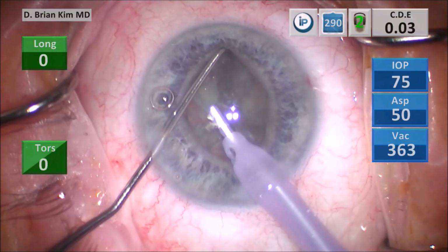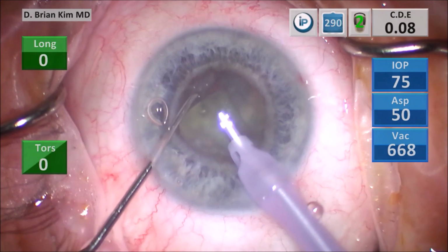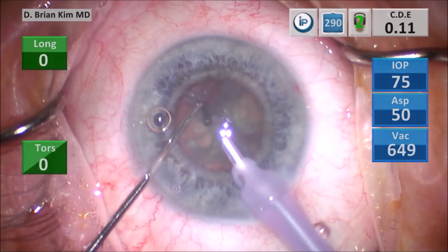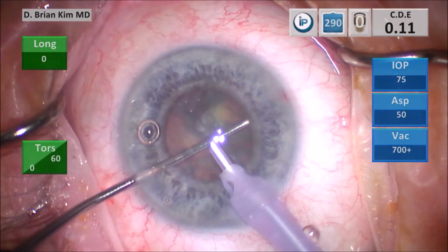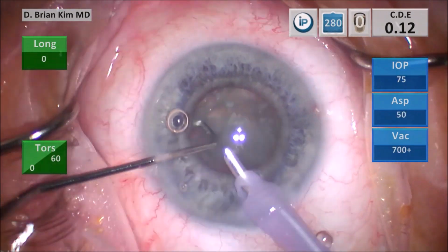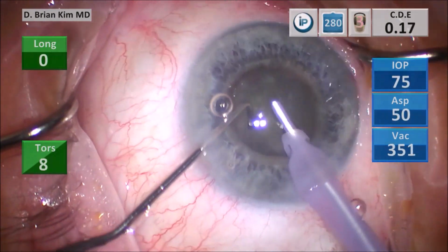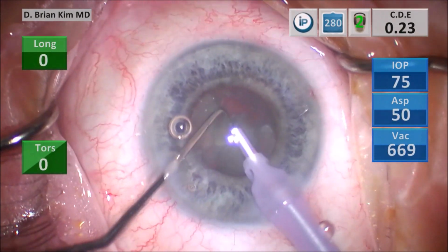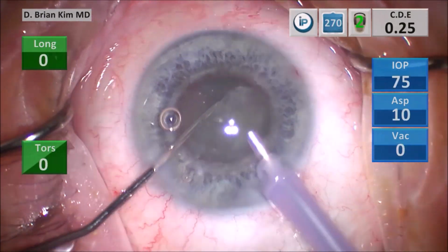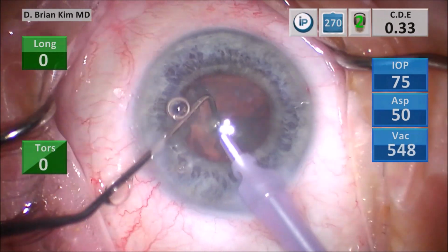I perform successive mechanical fracturing techniques and maneuvers where I'm taking the chopper out to the equator and then crushing the lens between the chopper and the phaco tip, placing the phaco tip in the middle of the bag underneath the lens material to make sure I'm able to sandwich the girth of the lens material with each mechanical fracturing maneuver. Once the pieces are small enough, I pulse it with some vacuum as well as ultrasonic energy. And you can see this 2+ dense lens in the context of a small pupil went fairly easily.